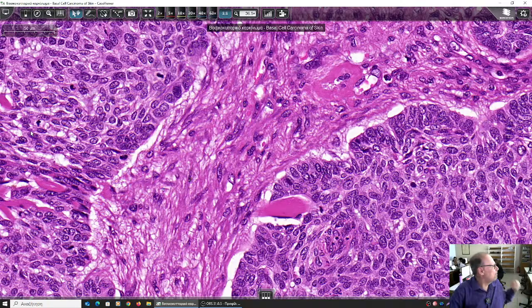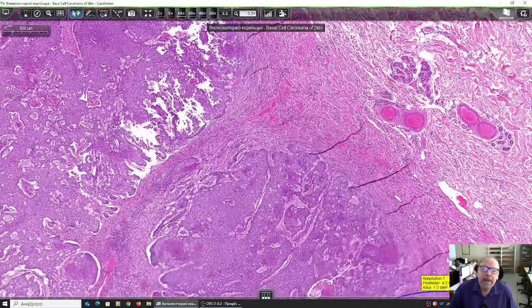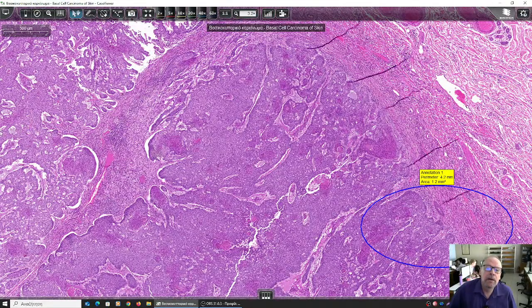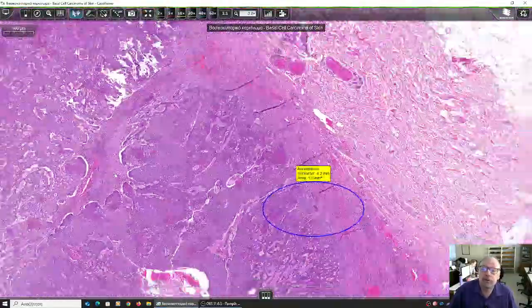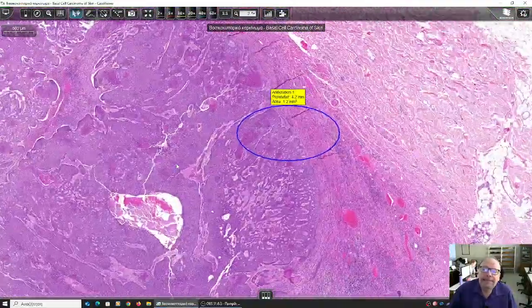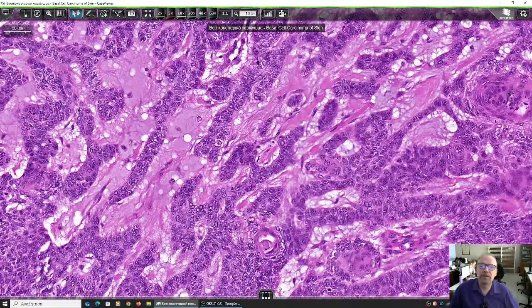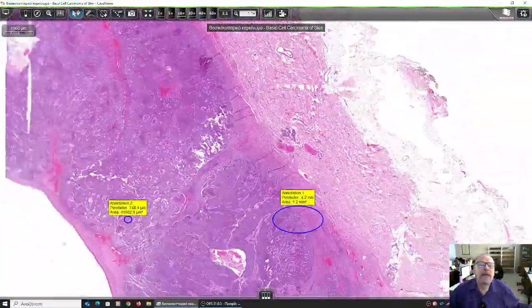So yes, these are mitoses. So it's a mitotically active neoplasm. So how can you see that in the way it grows in its stroma, because I'm not sure that we can talk of the dermis. This appears to be the stroma of the tumor. At least in some areas, it is not so regular. Would you describe all these small projections of neoplastic cells within its tumor as being benign endophytic projections? No, it appears somehow invasive.